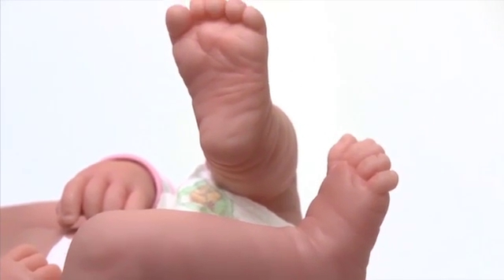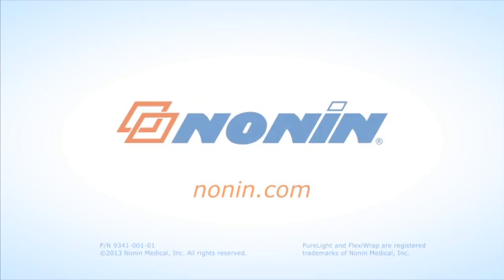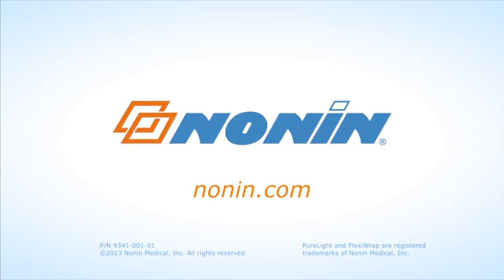You may rotate to the other foot on the patient to maintain skin integrity and patient comfort. You can find additional use information on this and other Nonin products at www.nonin.com.